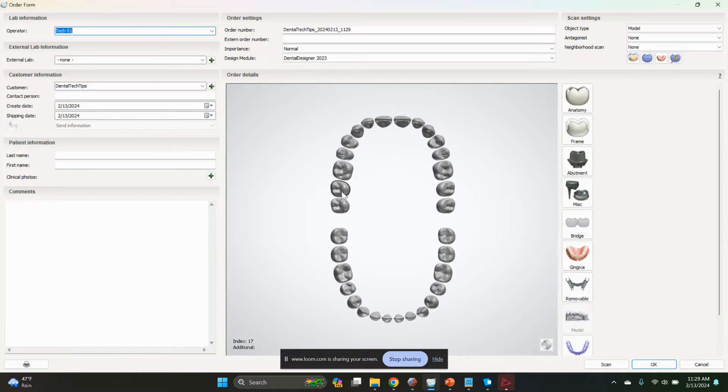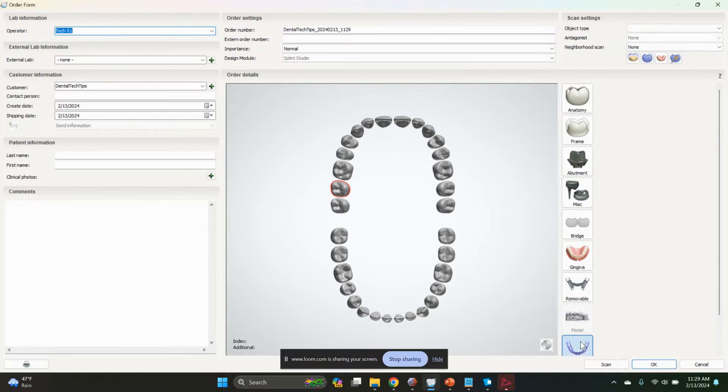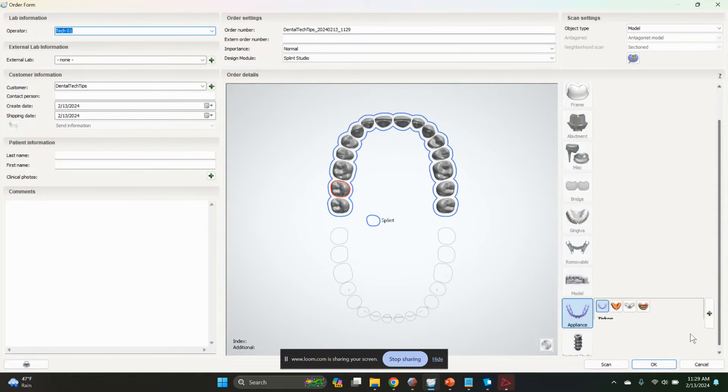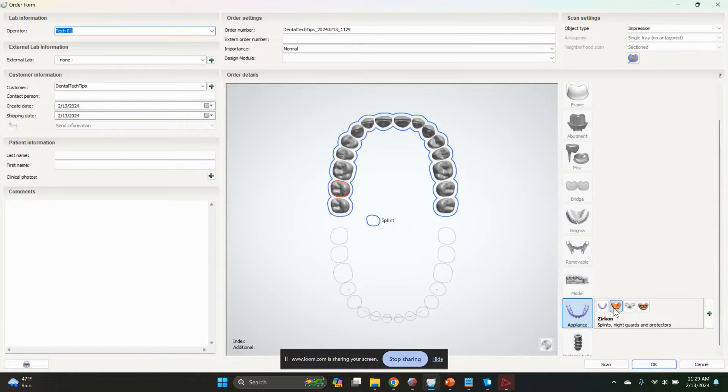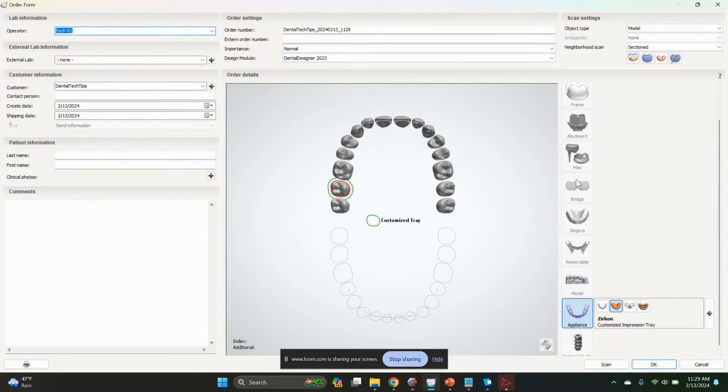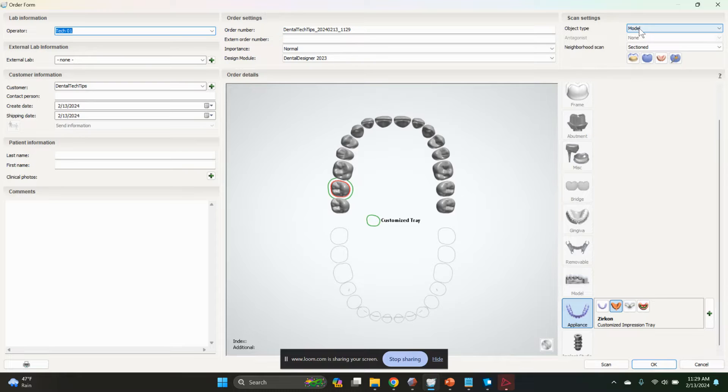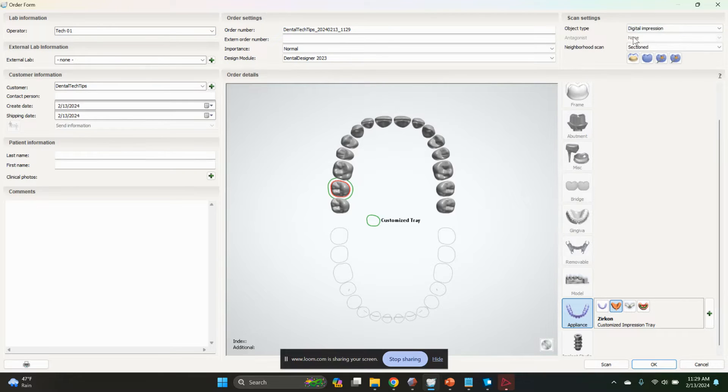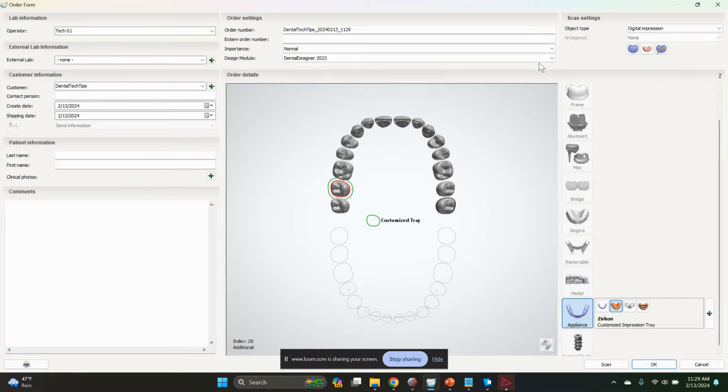Order form - just select a custom tray. This works as well if you don't have removable module or anything like that. We're just going to make it a digital impression. Go ahead and hit okay.